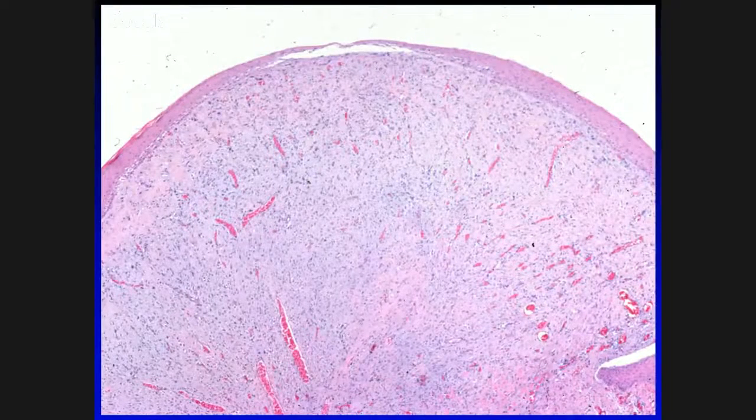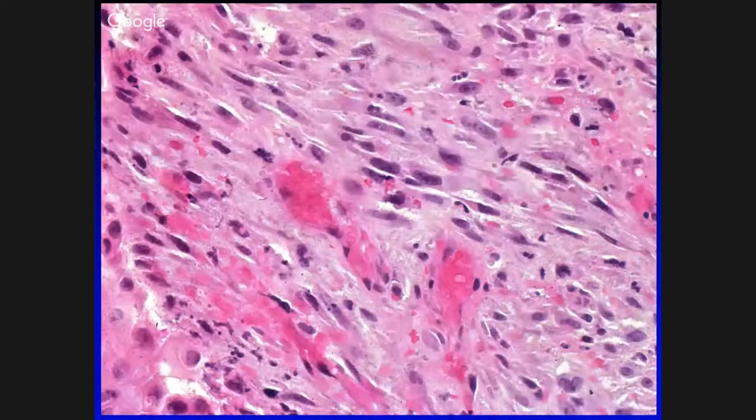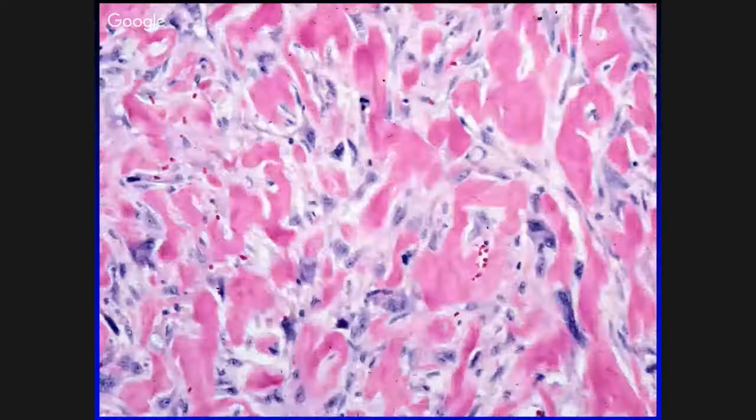Here's a polypoid lesion of the vocal cord in which the surface epithelium may have been ulcerated, at least in the top middle, but it's attenuated. There's no dysplasia. There's no invasion. If you look at this, the vessels are oriented perpendicular to the surface, which is often seen in a reactive granulation tissue-like phenomenon. If you only look at this magnification, this could be granulation tissue, except that at higher magnification in the areas there are malignant spindle cells.